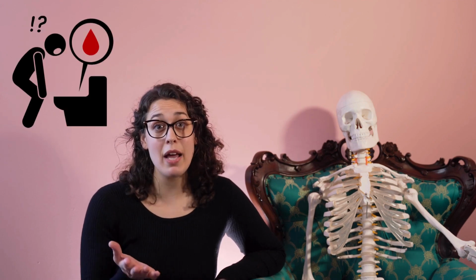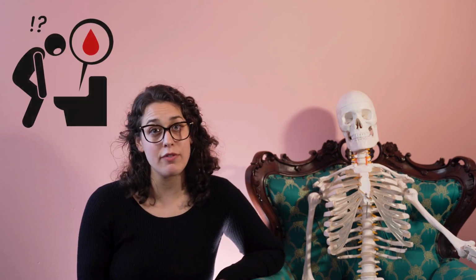What are the reasons someone might need a colonoscopy? Well, there's various reasons for this, George. Commonly, we perform colonoscopies to screen for colon polyps or colon cancer. Additionally, if someone experiences rectal bleeding, that is blood out the rear end, sometimes a change in bowel habits, iron deficiency anemia, or maybe they have a family or personal history of colon cancer, a colonoscopy may be recommended. Chronic unexplained abdominal or rectal pain or an abnormal x-ray exam may also be a reason to consider the procedure.